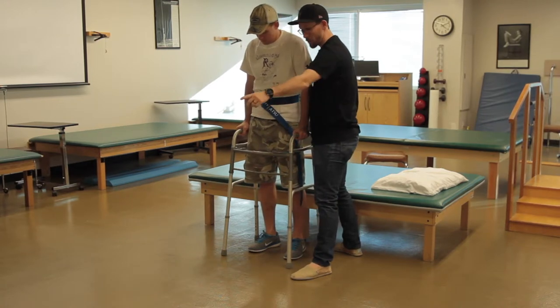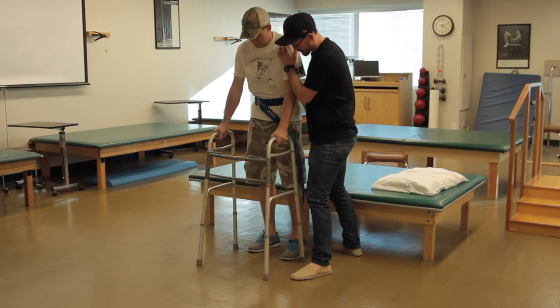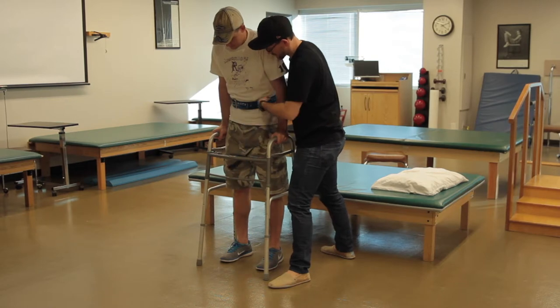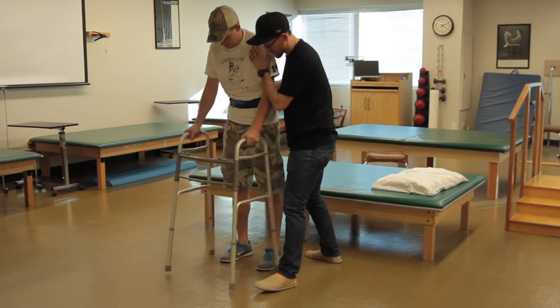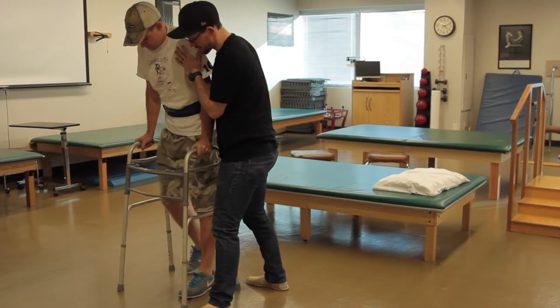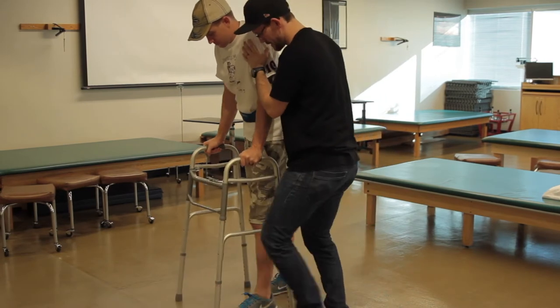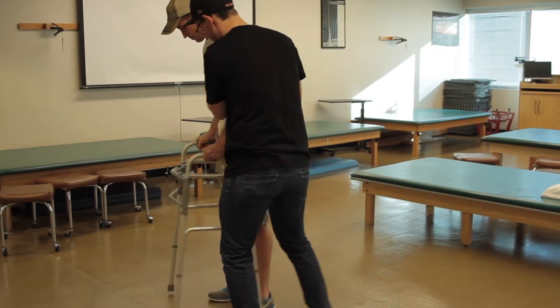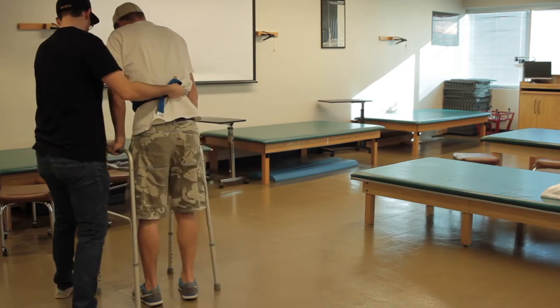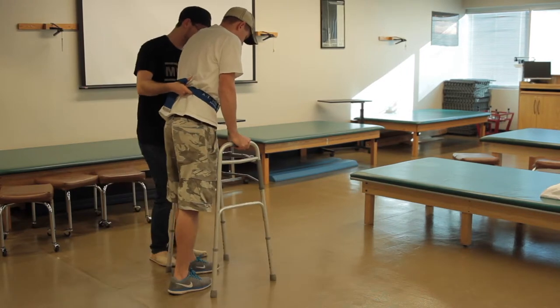So now, while we're walking, I want you to place the walker forward, and then your left hip, and then right. Good. I'm going to move this. And follow that same pattern. Walker, left. Good. And now I want you to turn to your right side, because that's your strong side. Good. And head on back to the mat.